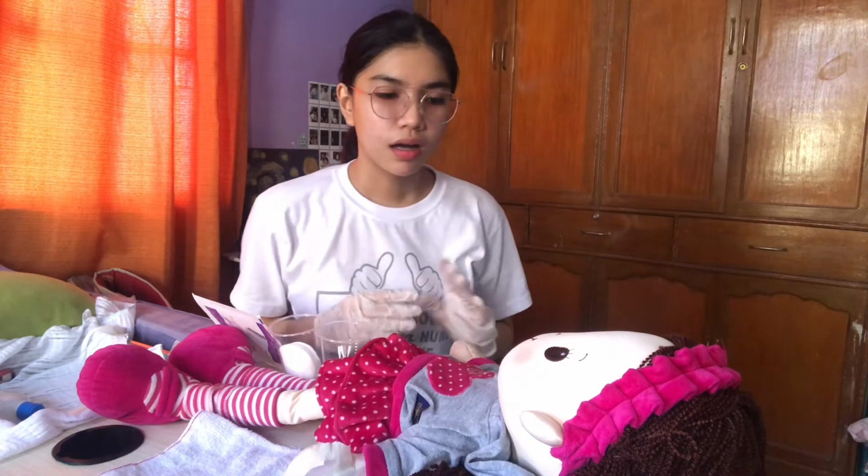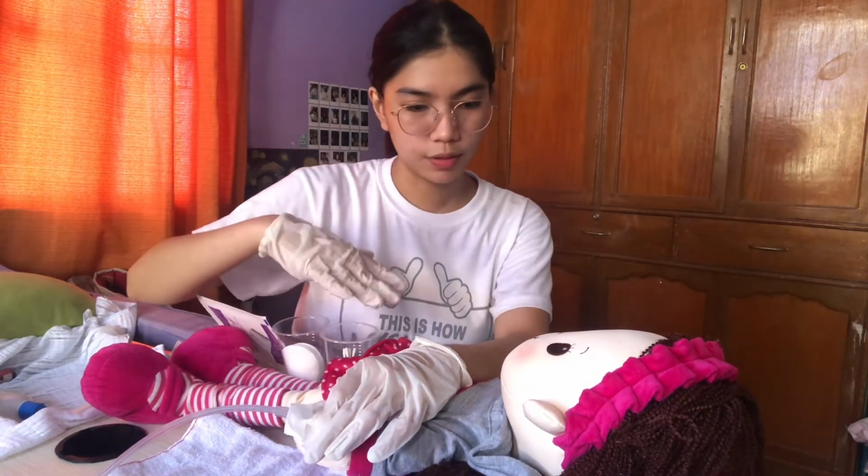Remove soil dressing and all the tape except the tape that is holding the catheter or IV needle in place. Ma'am, I'll be removing the tape and gauze from the old dressing one layer at a time. And also, I'll be removing the adhesive dressing in the direction of your hair growth if possible.